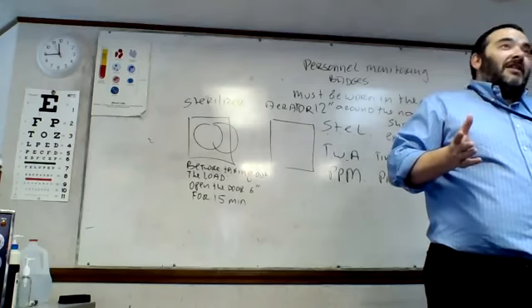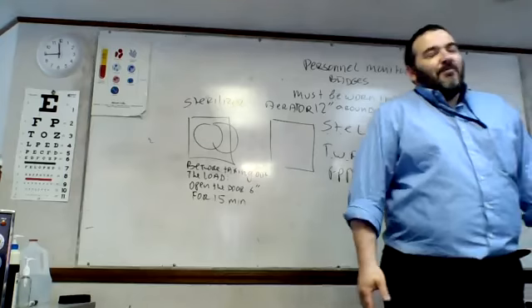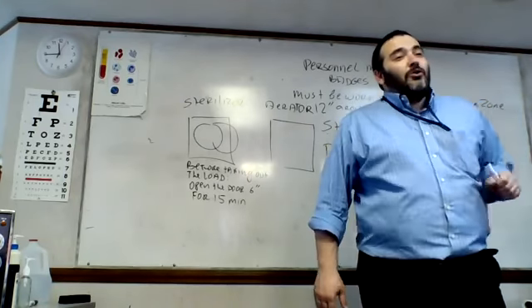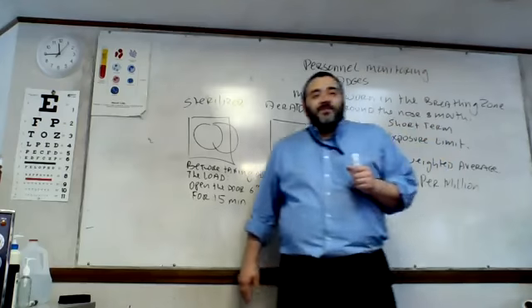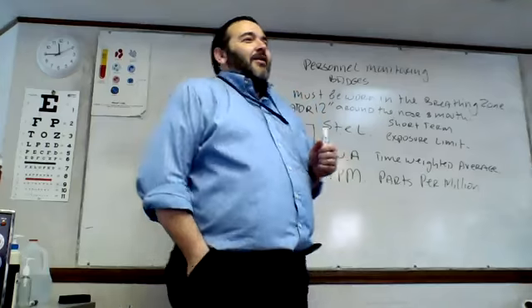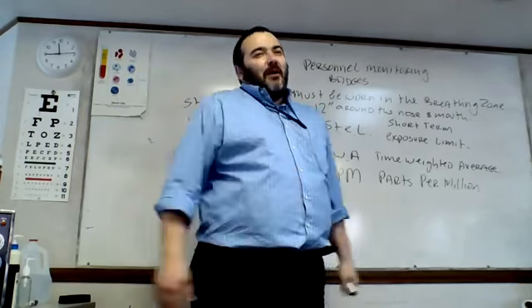You should know approximately what 6 inches looks like. If it's 5 inches, it's fine. If it's 7 inches, it's also okay. If it's 8 inches, all right. But the test says 6 inches. How do you know? Use your best judgment. Does this make sense? 15 minutes. Let it air out a little bit, let the fumes come out.